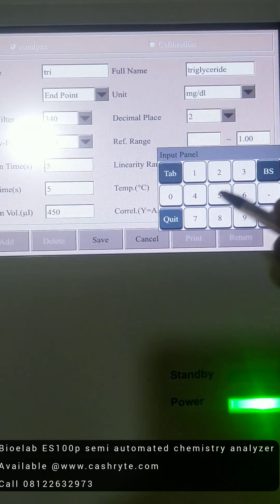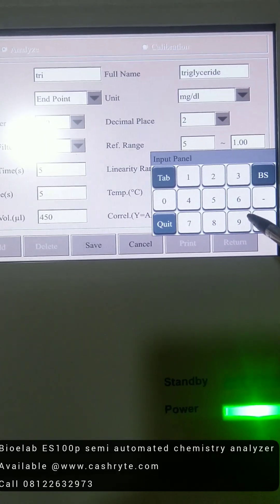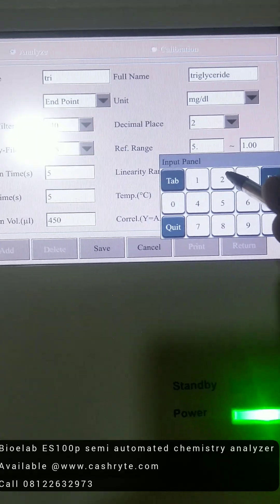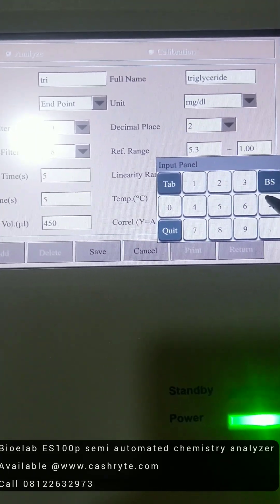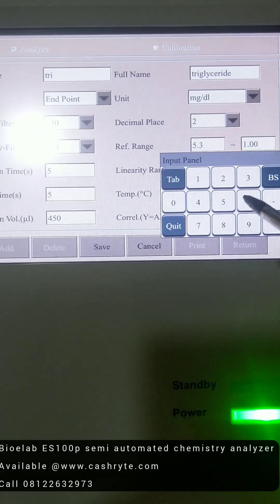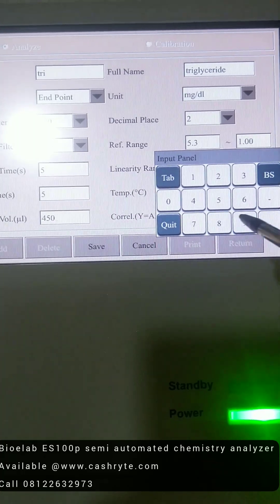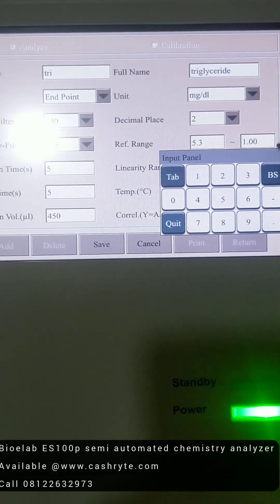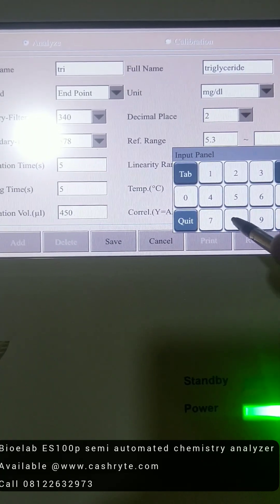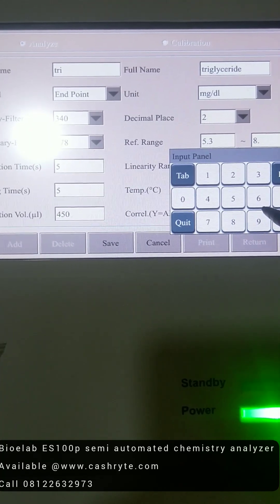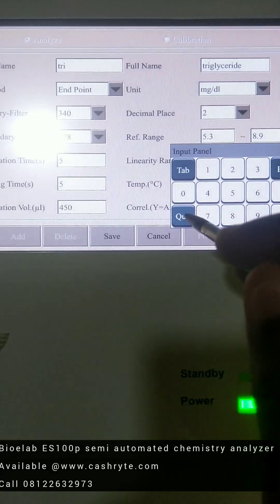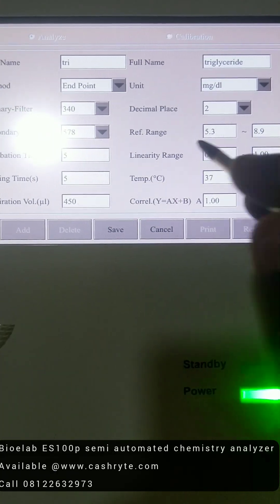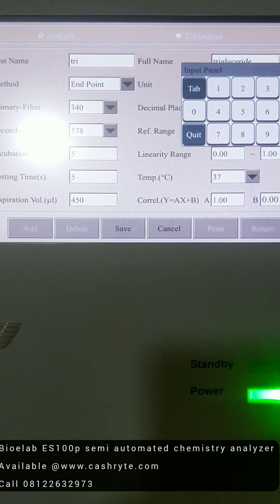Then you set your reference ranges as well. For example, let's just say 5.3 to 8.9. We're just assuming that's the reference range. Depends on what parameter you're doing. So you set that. You set your linearity.